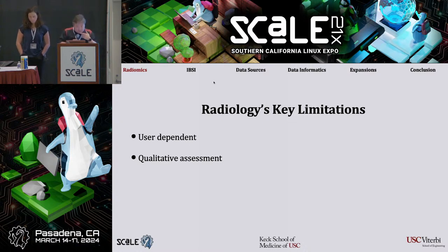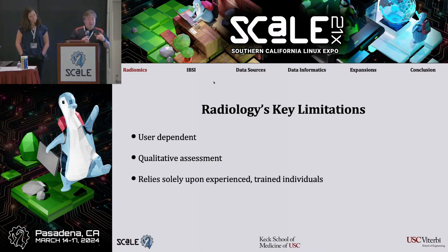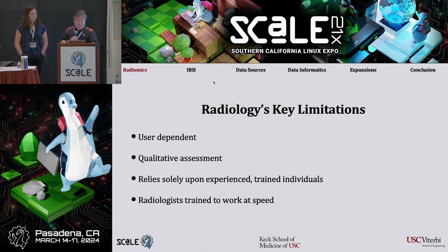Again, it's a qualitative assessment most of the time, not quantitative. And then finally, it relies really on the experience of both the person conducting the study, which is probably a tech of some sort, a sonographer or a radiology technician, and the ability of the radiologist to interpret those images. So lots of things that can result in human interpretation and thereby human error.